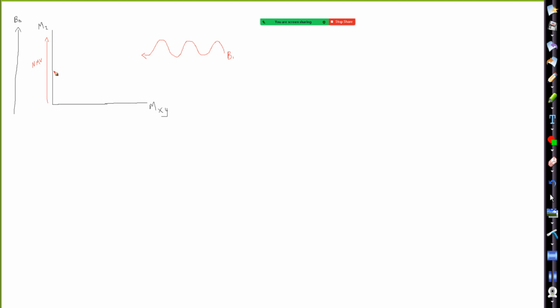All right. So then we got to flipping this net magnetic vector into our transverse plane. And that flip angle was based on two things. What were those two things that determine a flip angle? Amplitude and duration. Amplitude and duration. Good. So in the simplest form, we just talked about how our flip angle thus far is 90 degrees. Because that's desired because this is where our coil lays on the patient, right? And this vector is going to flip into the transverse plane.